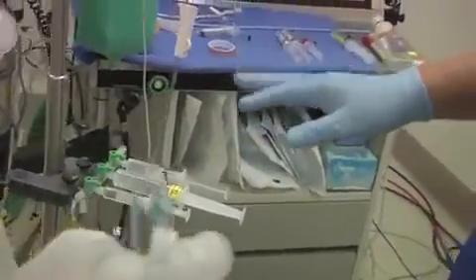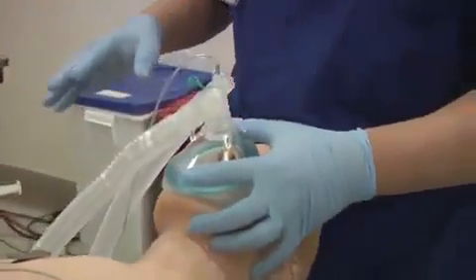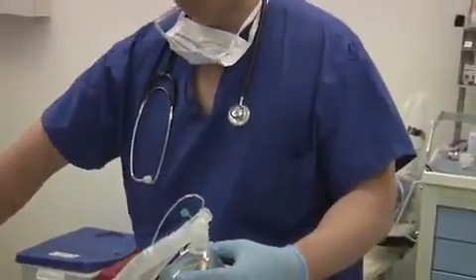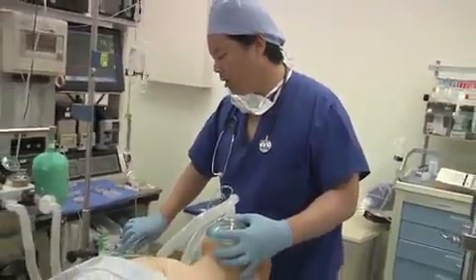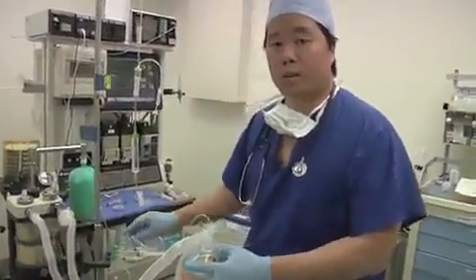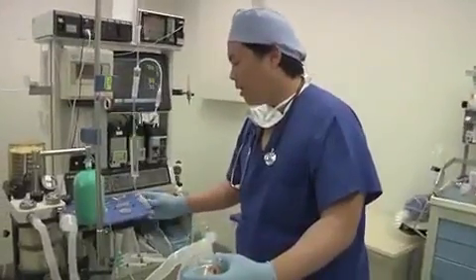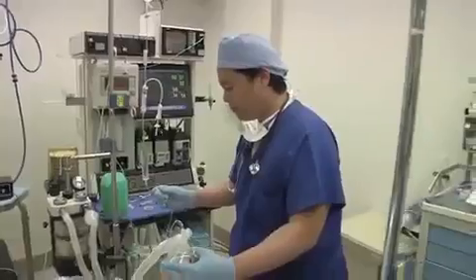So while I've done this, we've fully pre-oxygenated the patient, and at this point we're ready to start inducing anesthesia. I'm going to begin just by giving some fentanyl. 2 micrograms per kilo is usually sufficient to ablate the hemodynamic response to laryngoscopy. And I'm going to make sure that that medication gets flushed in.